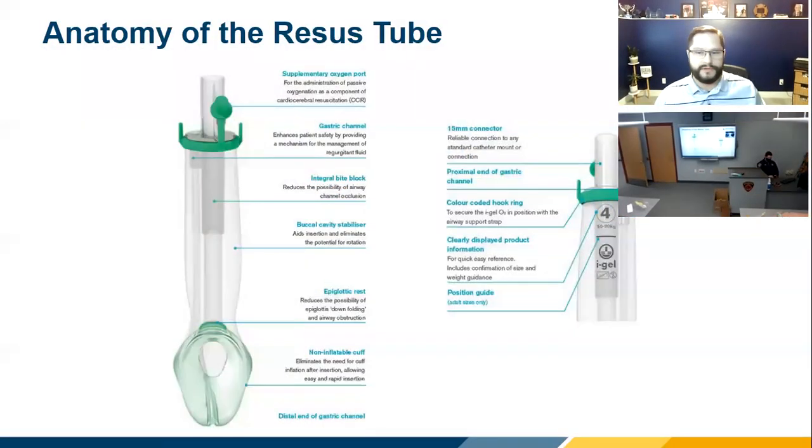What I always do is start with the anatomy of the tube, because that's the important thing to figure out first. You guys have a few of them sitting on the desk in front of you. Like every airway device, there's a 15mm connector on top — your end-tidal CO2, your filters, your BVM, all hook right to that 15mm connector.